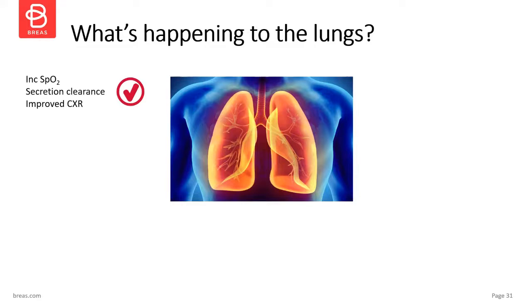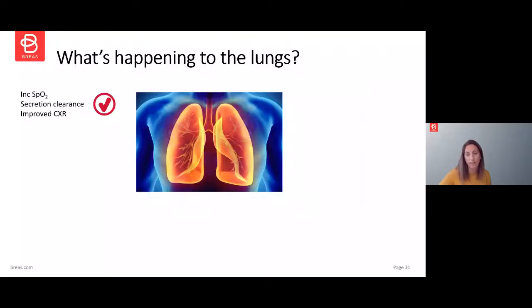So that's really important. But when we're thinking about over-distension, is any change in volume that we're getting in agreement with what your lung compliance is saying? So is the change in lung compliance appropriate to the change in volume? Because actually, if your compliance is staying the same or reducing, then you're probably over-distending areas rather than opening up new areas of atelectasis. And I think that's something that we need to be thinking about, and therefore using the numbers that are generated on the ventilators.